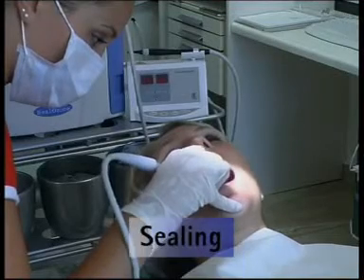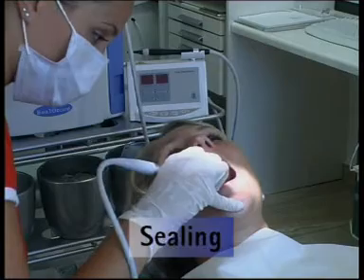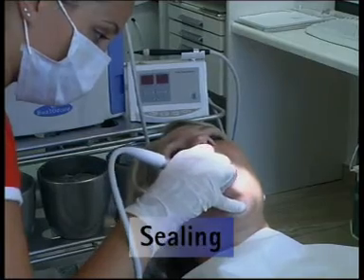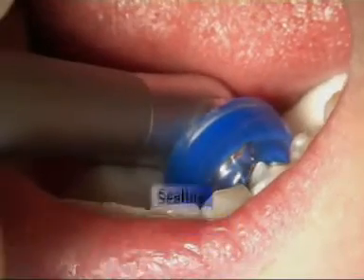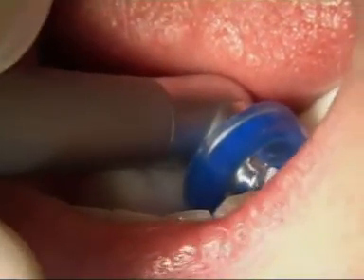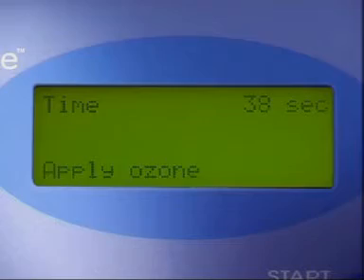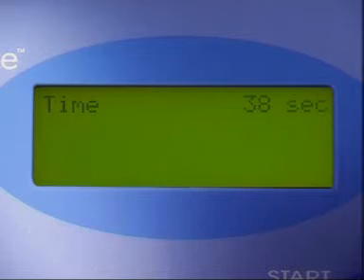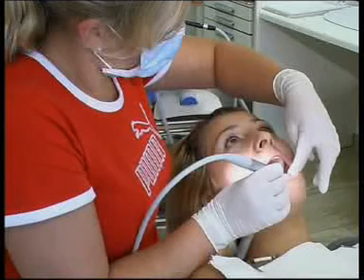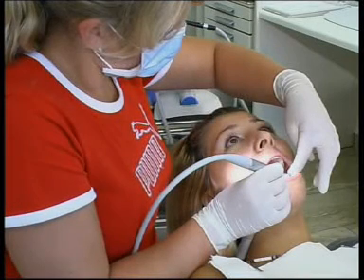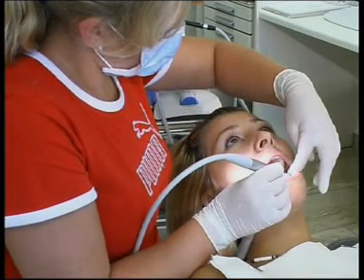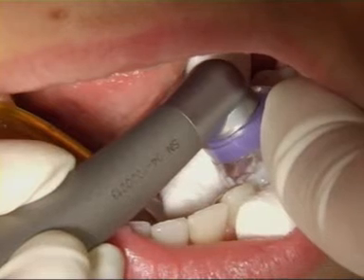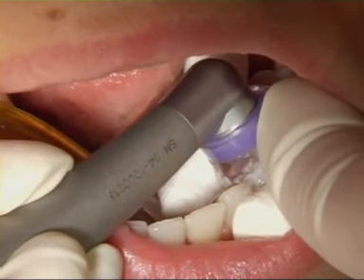What if the airtight seal is lost during the treatment? Treatment is automatically interrupted until the airtight seal is restored. Check that the seal is tight at the tooth — it is often a good idea to press the cup firmly onto the tooth.